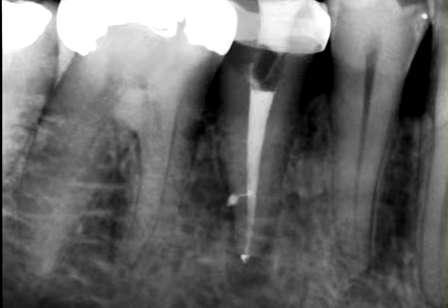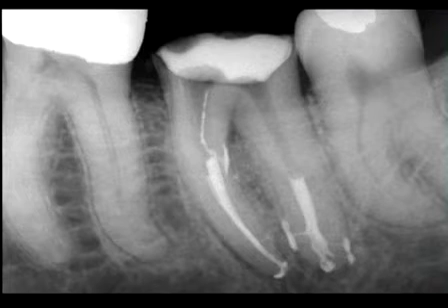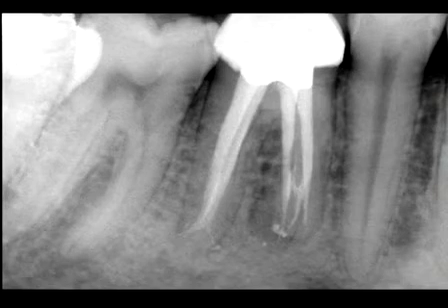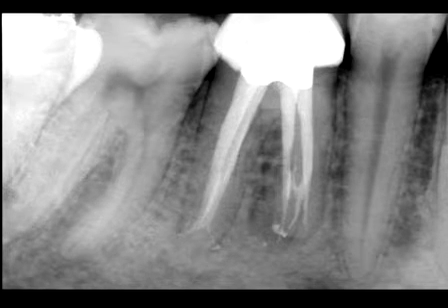Shaping facilitates packing by removing restrictive dentin, which allows instruments to work deep, unrestricted by dentinal walls, and to subsequently move thermosoftened gutta-percha and sealer into all aspects of the root canal system. In summary, the shape is critical, not only for effective cleaning, but for 3-dimensional obturation. Consistently producing the shape is one of the strategic cornerstones in the foundation of endodontic success.